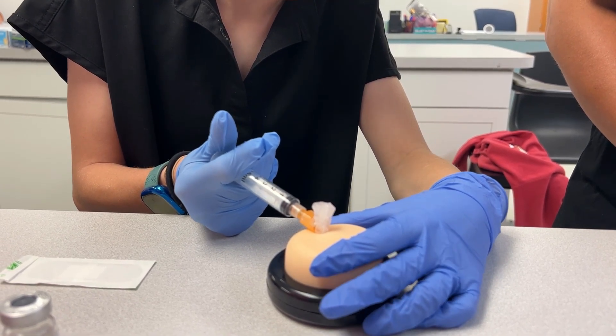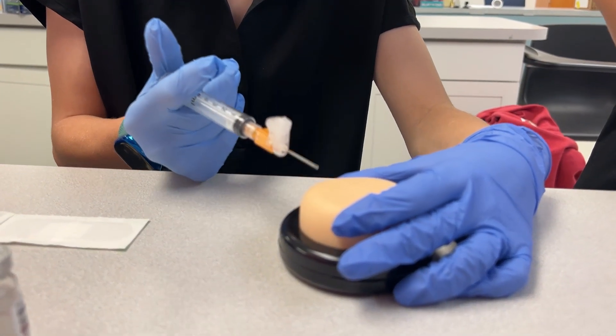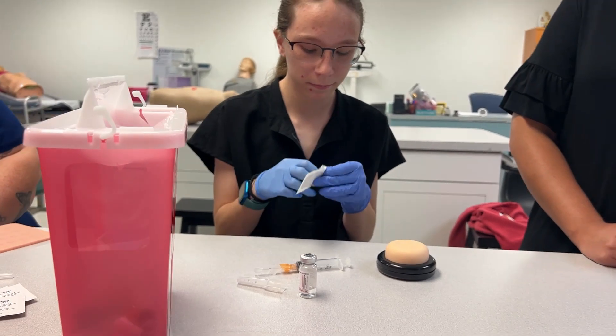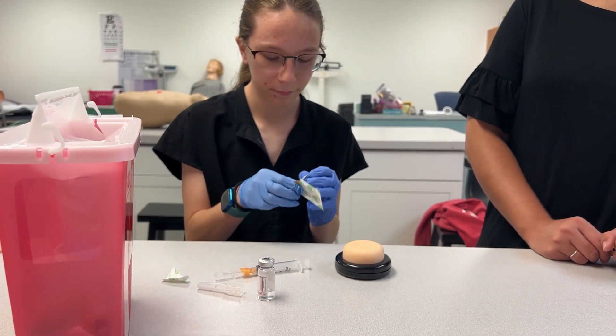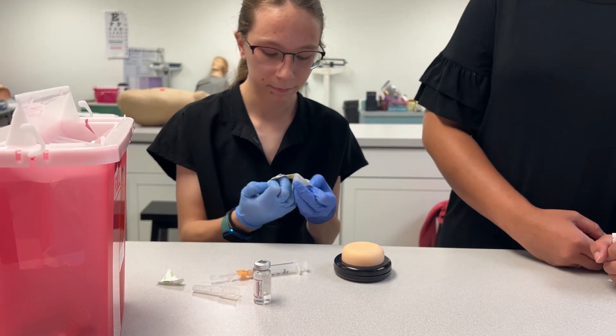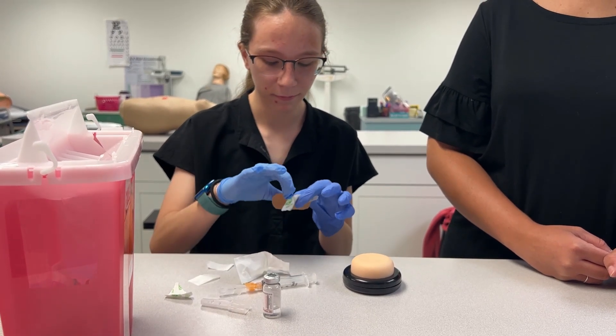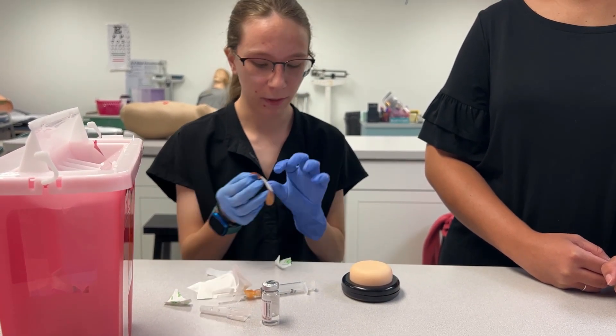Pull straight back out. Good job — activate your safety device and put your band-aid on, and you are good to go. Let me get the band-aid open.